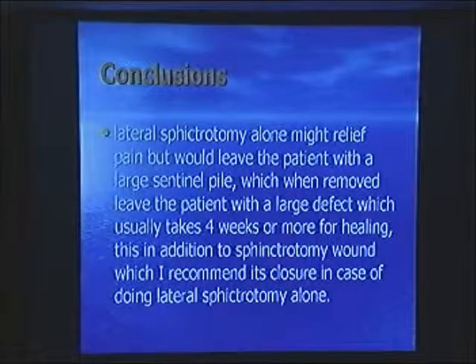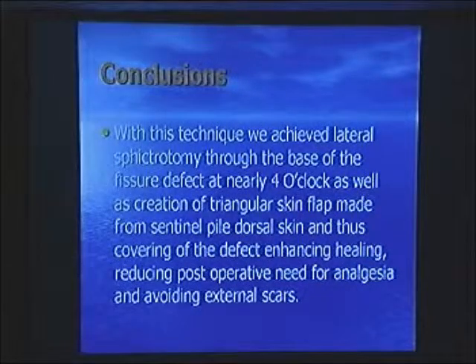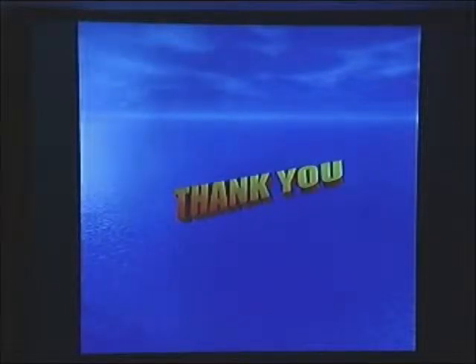We know that lateral sphincterotomy alone might relieve pain, but it leaves the patient with a large sentinel pile, which when we remove, leaves the patient with a large defect, which even when we close it leaves the patient with an ugly scar, and sometimes the raw area takes up to 3-4 weeks to recover. With this technique, we achieve the lateral sphincterotomy through the base of the fissure defect at nearly 4 o'clock, as well as creation of a triangular flap made from the sentinel pile skin, thus covering the defect, enhancing healing, reducing postoperative pain and avoiding ugly scars. Thank you.